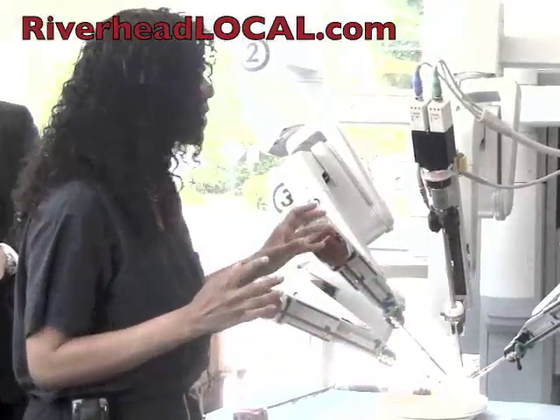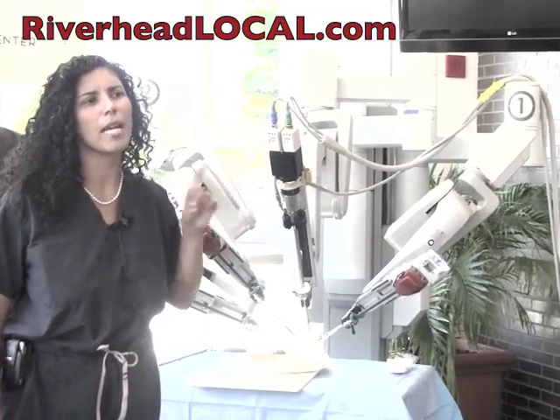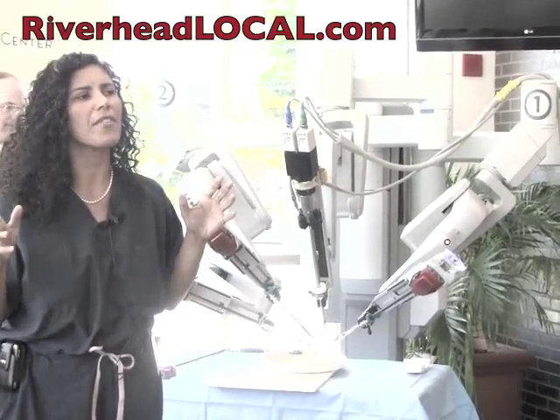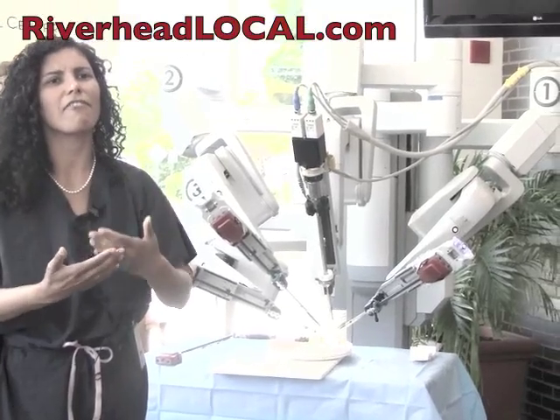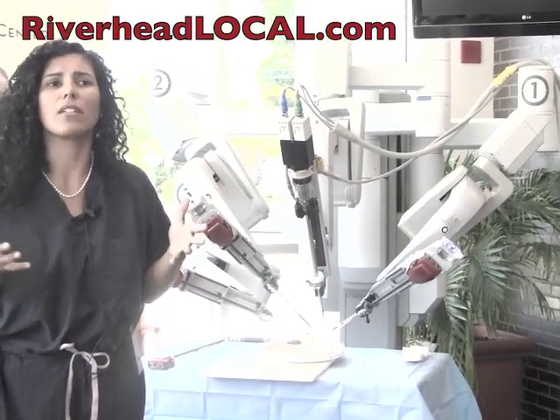The thing that the robot does, and you can't see it on our screen, I can only see it at the surgeon console, is that the robot has actually 2 cameras, not 1. And because it has 2 cameras, each eye gets its own vision. Instead of turning everything even into an HD image, it's like watching Avatar in 3D versus 2D. Your image is much better, your resolution is much better, and then rather than seeing a flat image on a laparoscopy screen, you have a 3-dimensional image that you could see in real life.